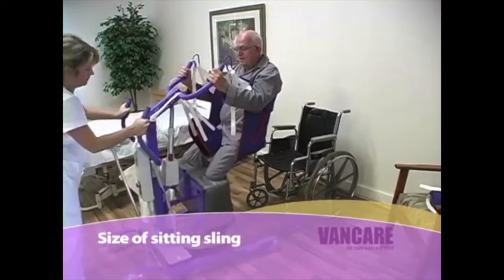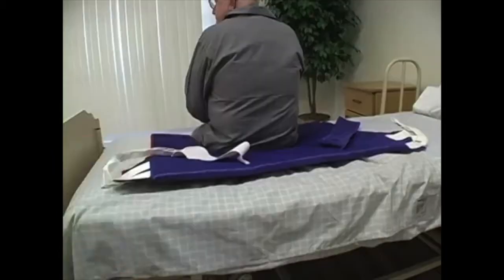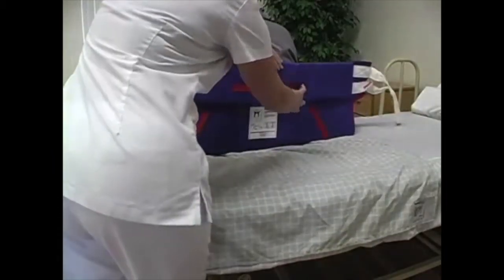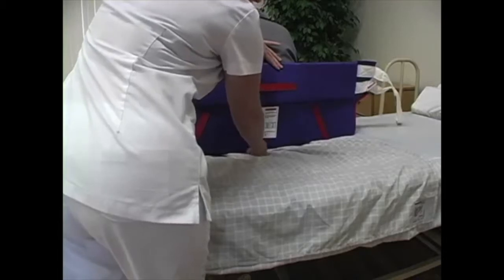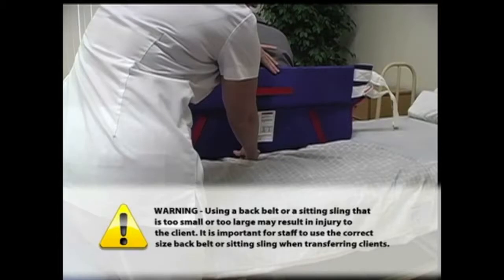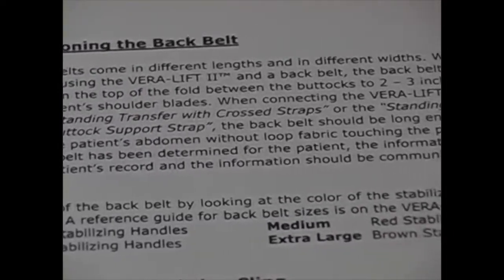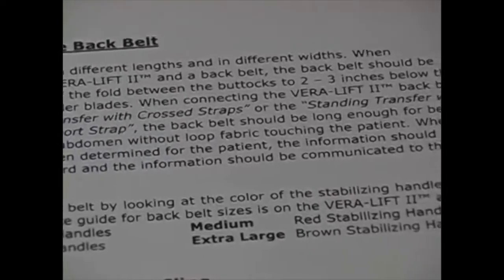Size of sitting sling. When transferring a client using the sitting sling, the sling should be long enough to fit from the client's coccyx to 2 to 3 inches below the level of the shoulder blades. When the correct size sitting sling has been determined, the information should be documented on the client care plan and communicated to the nursing staff. Using a back belt or a sitting sling that is too small or too large may result in injury to the client. It is important for staff to use the correct size back belt or sitting sling when transferring clients. Refer to the back of the Vera 2 operations manual or contact your distributor for information about sizes and types of back belts and sitting slings that are available.